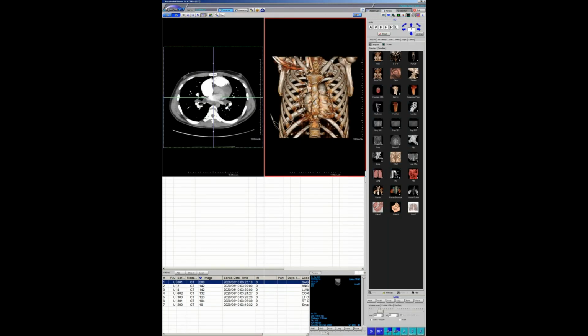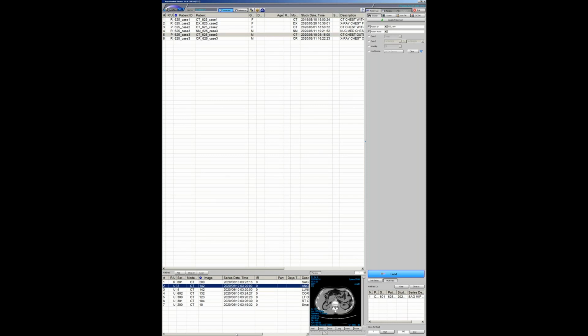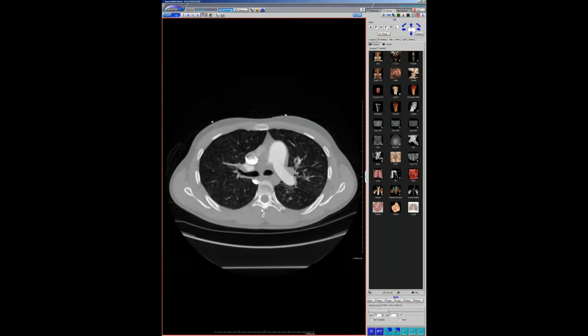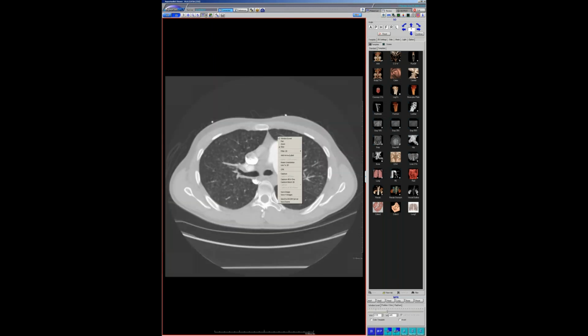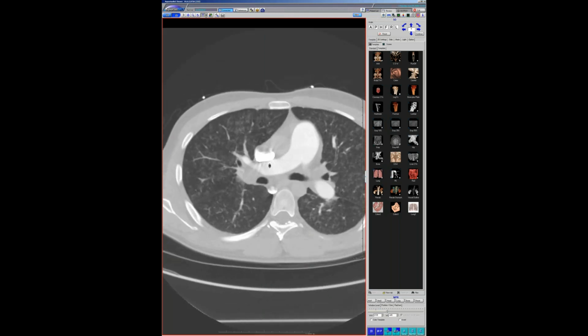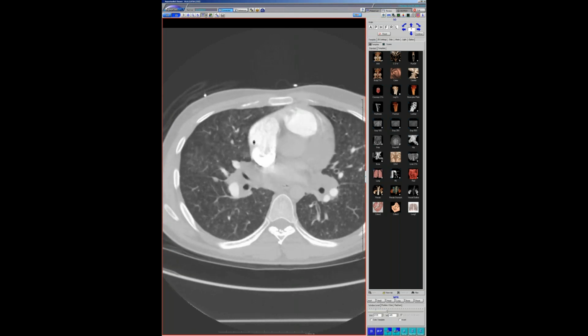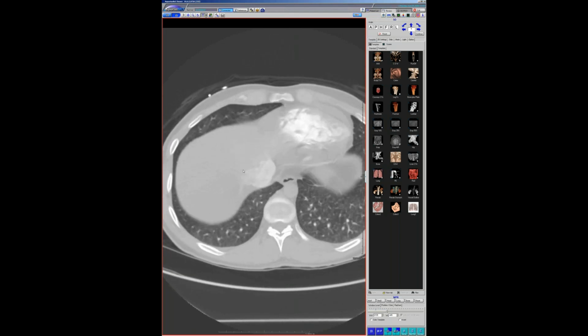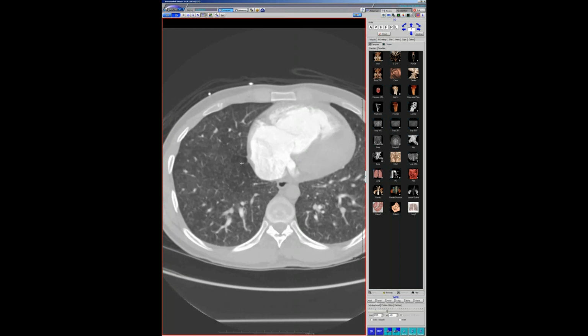Oops, that's the sagittal. Let me find where his... And these are always outside studies. Now, what's interesting here is a couple things. Let me just make this sharper. So, severe pulmonary hypertension, I think he underwent right heart cath. I think his PA pressures are in the 70s, 80s, and a lot of these nodules.